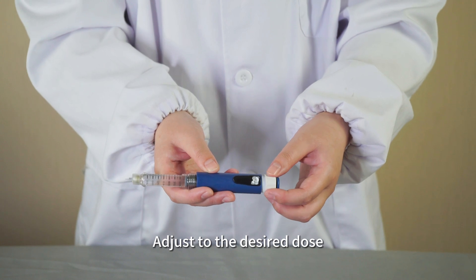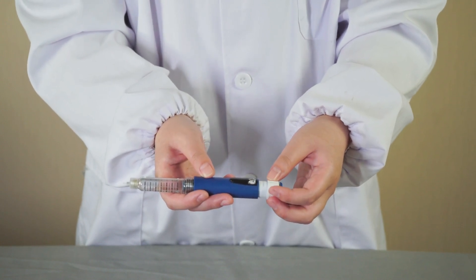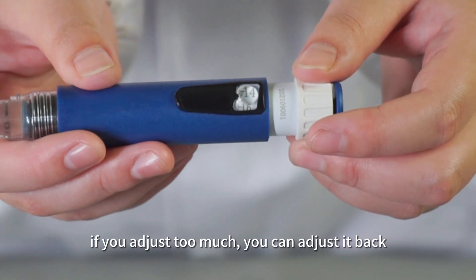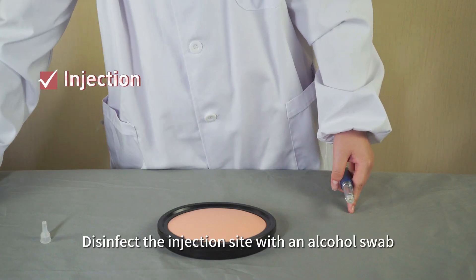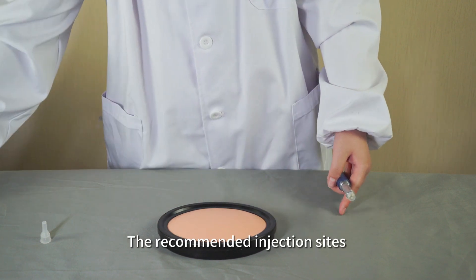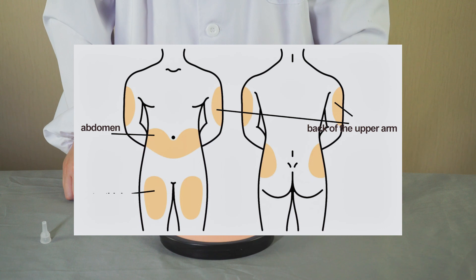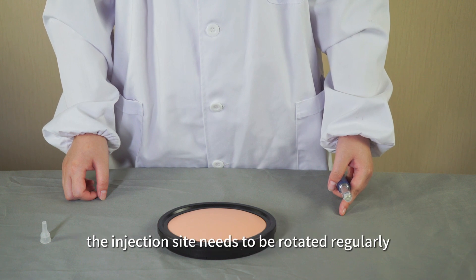Adjust to the desired dose. If you adjust too much, you can adjust it back. Disinfect the injection site with an alcohol swab. The recommended injection sites for regular insulin injections are shown in the diagram. To prevent issues such as lipohypertrophy and skin problems, the injection site needs to be rotated regularly.